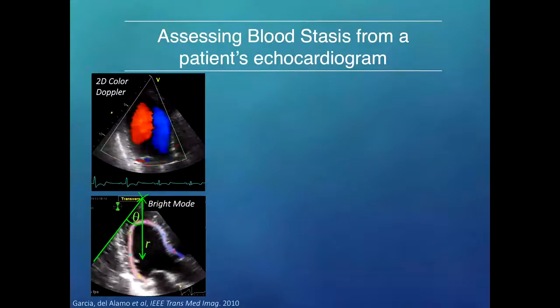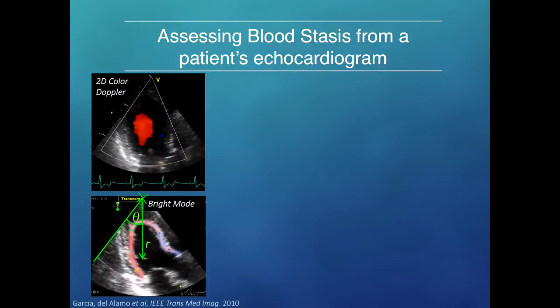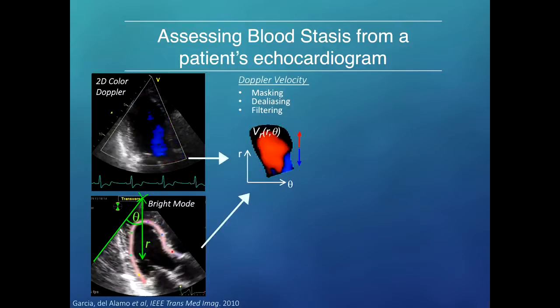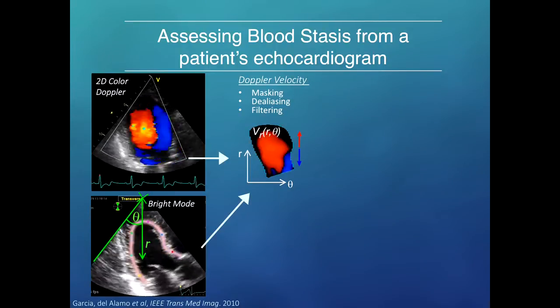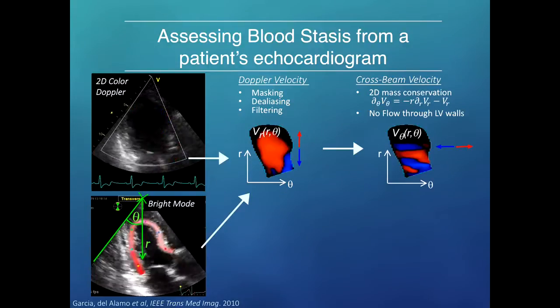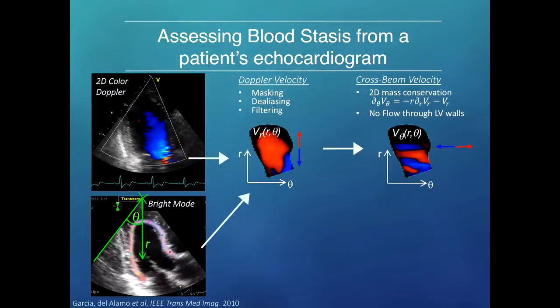So, in order to get a better idea of these multidimensional flow patterns, a few years ago we devised a method to analyze these images, which essentially are images that you can get any day at any time from an echocardiographic machine. The only thing is typically you don't use such a wide sector here, so we're enlarging the sector a little bit to encompass the whole ventricle. So we take these images, this Doppler velocity, we pre-process it a little bit to only look at the velocity inside the ventricle and smooth it out a little bit, and then we consider that flow of blood has to conserve its volume, so blood cannot be created or destroyed inside the ventricle.